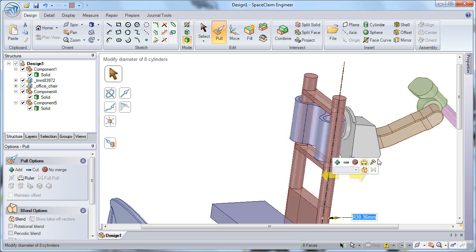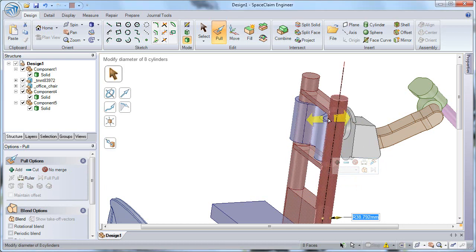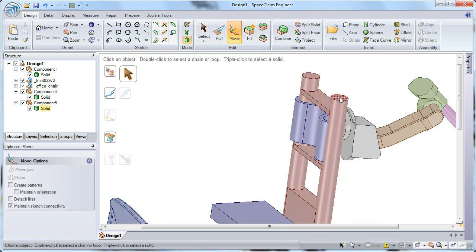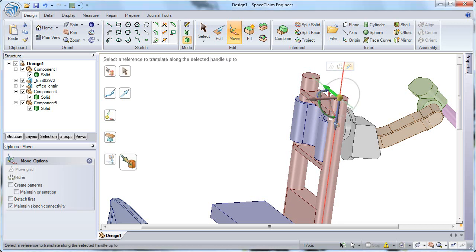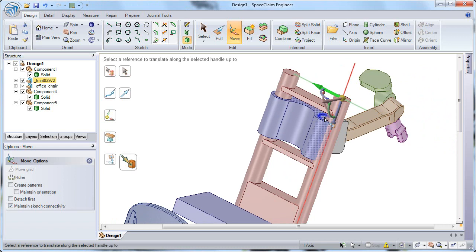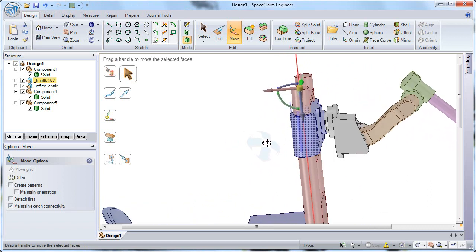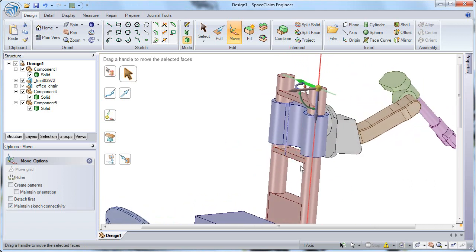So I can click on the solid, choose the Up To command, and then choose a reference for the inside cylinder of that arm. Now I'd like to make sure that my two arms are in place correctly, so I'll select on the center axis using the Move tool and move that center axis up to the inside wall, or up to the axis for the arm. And now I have a perfect fit between those two components.